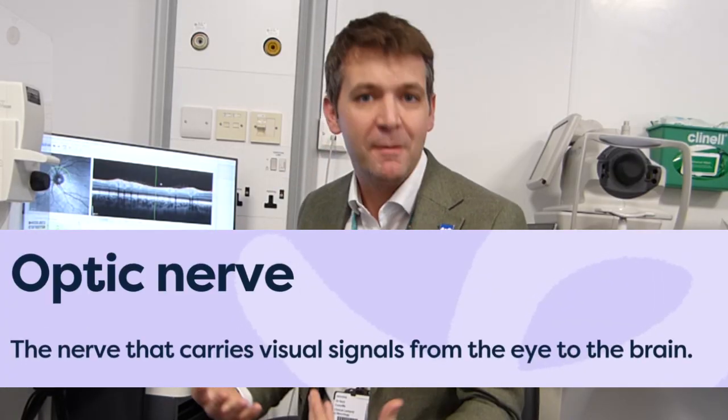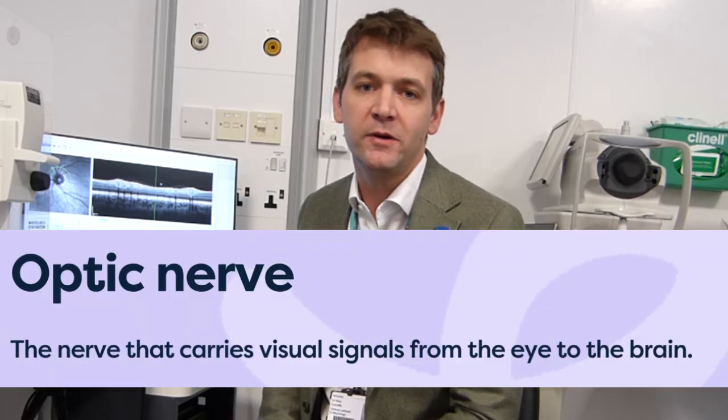Because we know that if there is a significant difference between the left and the right, that's a very clear marker to us that MS has affected one of the optic nerves, the wire that leads into the back of the eye, that MS has affected one of those nerves at some point in the MS journey.